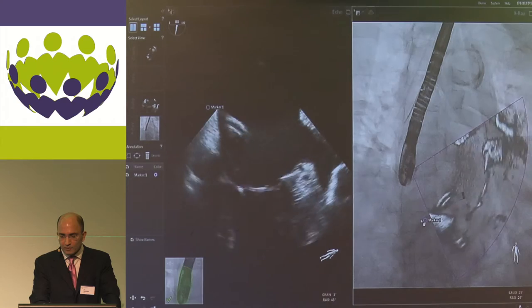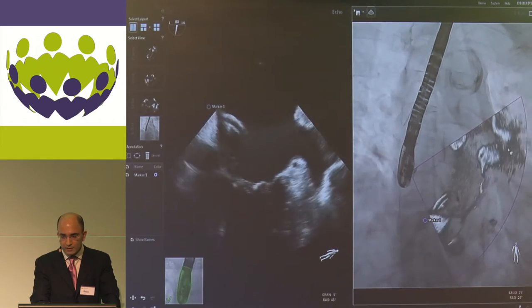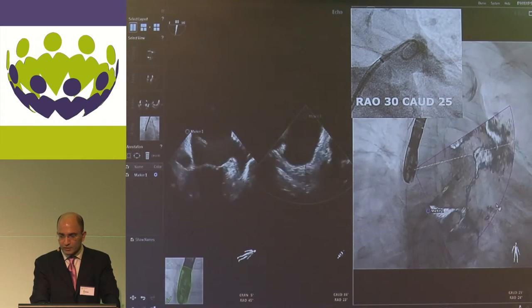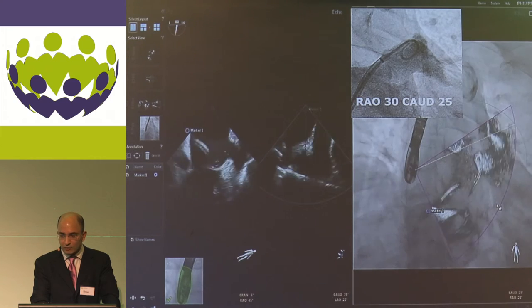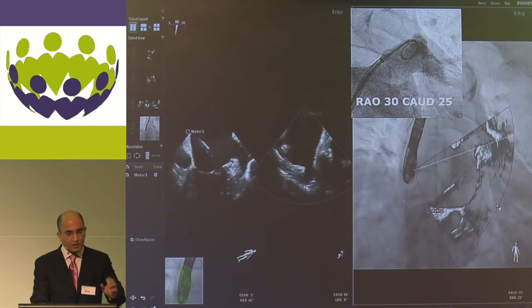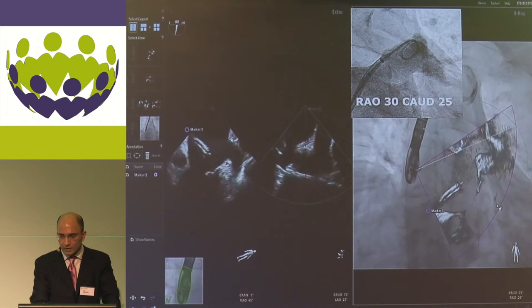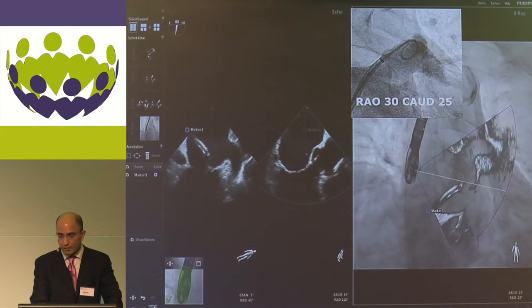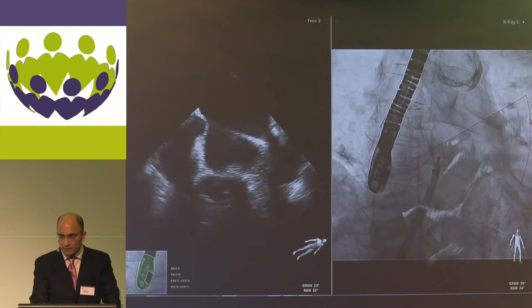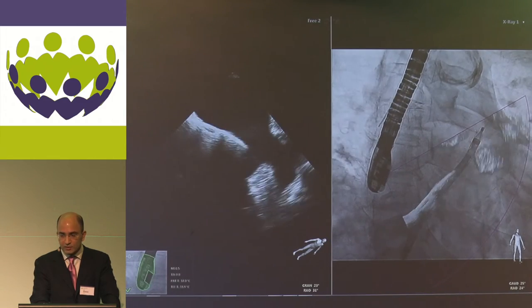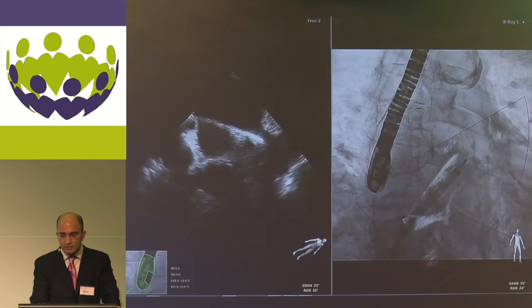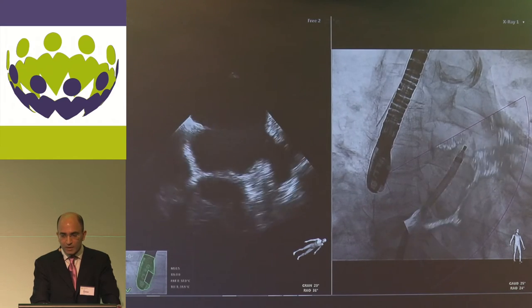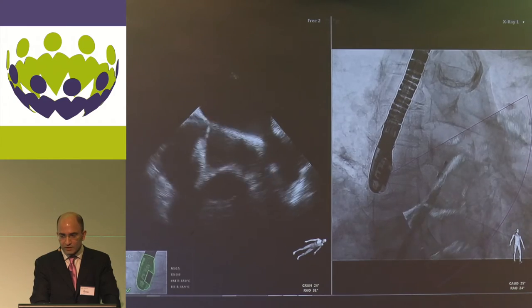The view on the fluoroscopy screen is equivalent to what you see when you inject the appendage in the same orientation. For example, at 30 degrees and 25 degrees caudal angulation, the fused echo image on X-ray matches exactly what you obtain with contrast injection. This clearly shows the position of the delivery catheter relative to the appendage and mitral valve, allowing safer device loading. On echo alone it is difficult to see the catheter tip, but with X-ray fusion you see exactly where you are going — potentially making the procedure less traumatic.